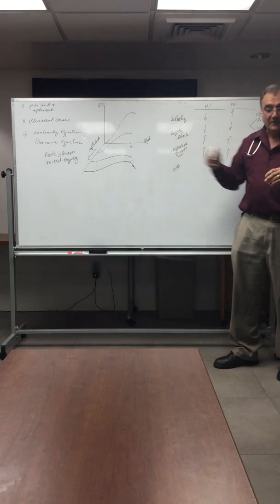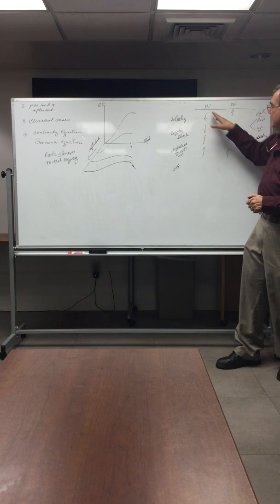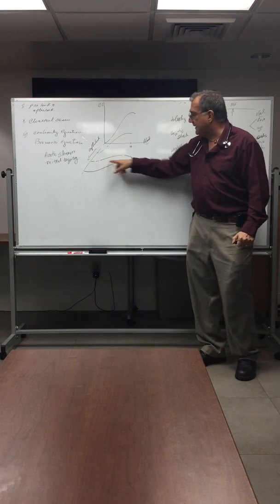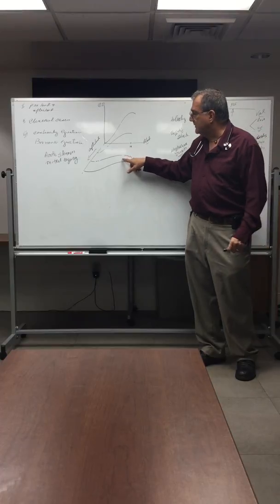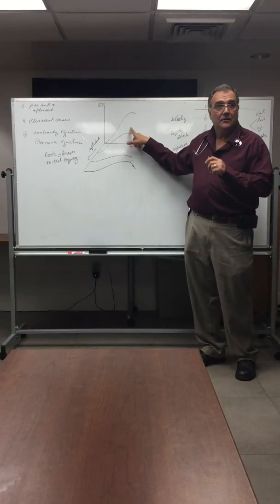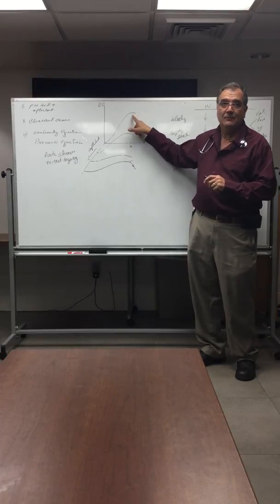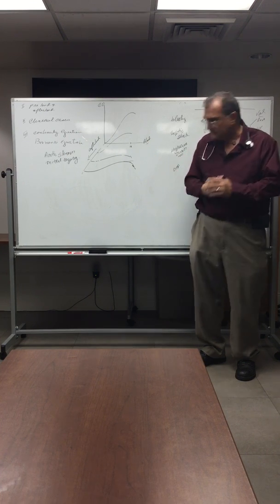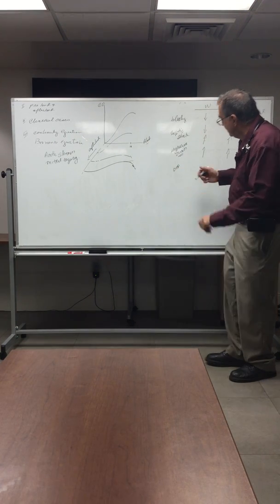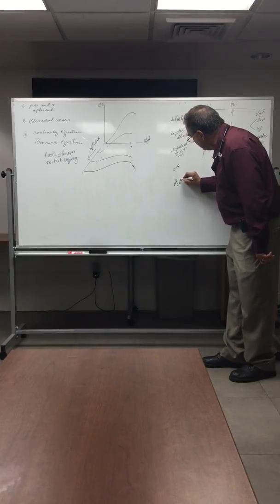So you see, all I'm doing with this curve is finding out with the clinical condition what I am in terms of wedge and afterload, okay, finding out where I am on the curve, and then doing the appropriate therapeutic intervention to move this way to increase the cardiac output this way, or this way, or this way to increase the cardiac output, whether I have a very high wedge or a very low wedge. Make sense? Okay.